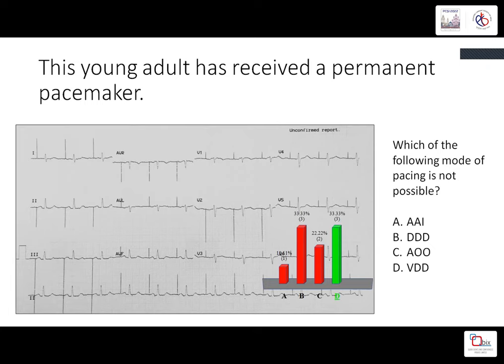Okay, what is this pacing? What do we see here? Atrial pacing or ventricular pacing or both? All of you agree that it's atrial pacing? The pacemaker spikes are quite big, and generally we don't see them this big, so it's probably unipolar pacing. We have seen atrial pacing, right? Do we see ventricular pacing here? No, we don't see it. All are conducted PRs. So there is atrial pacing and ventricular conduction is there.